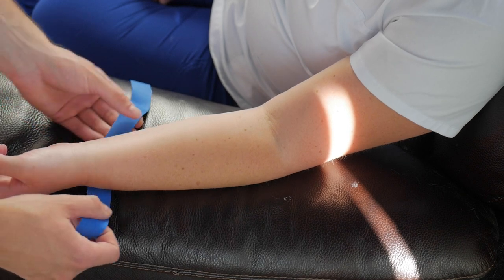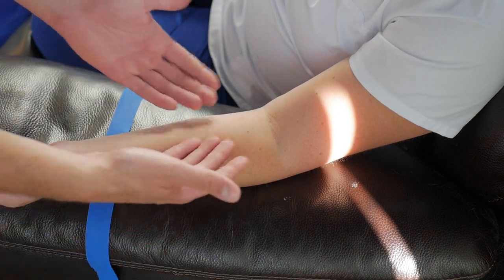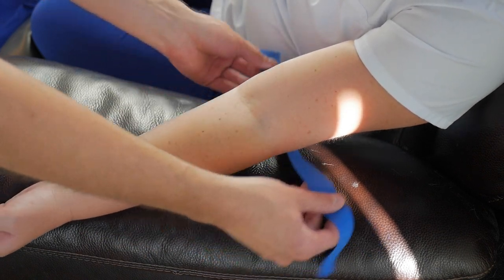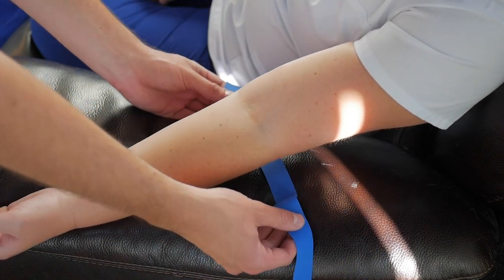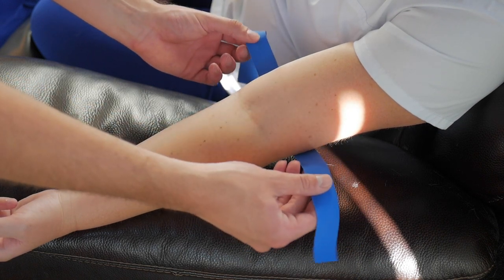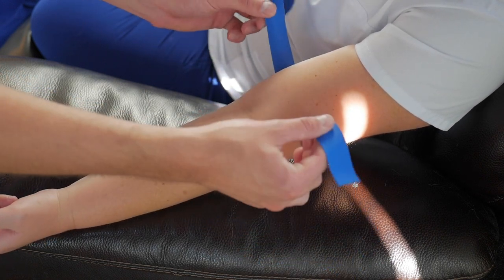Alright guys, this is how you're going to tie a tourniquet. First you're going to have the patient put their arm above the tourniquet and slide it up to the point at which you want it. For an AC stick you probably want to go just a couple inches above where you plan to put your needle in — right about here is good.